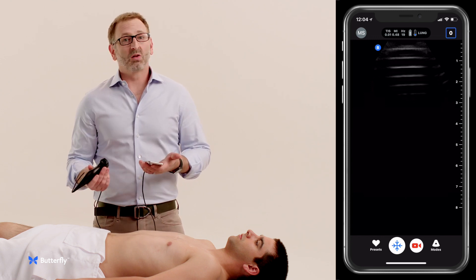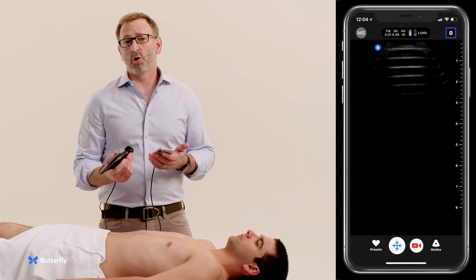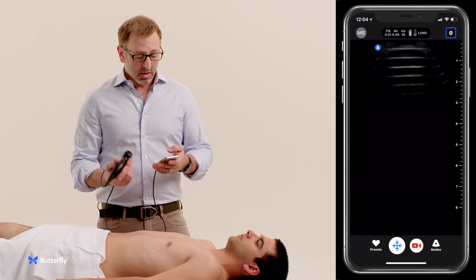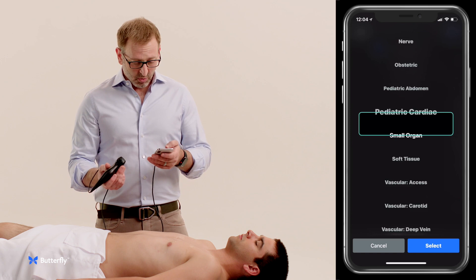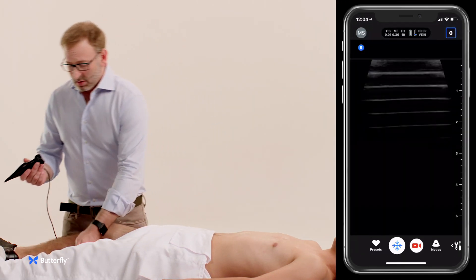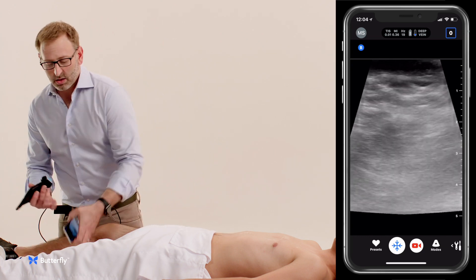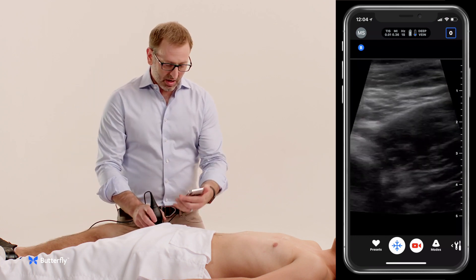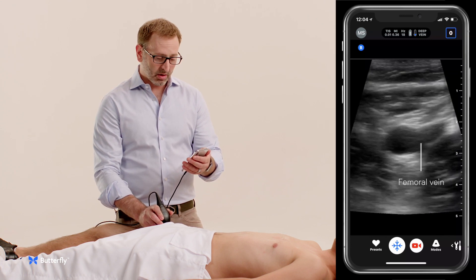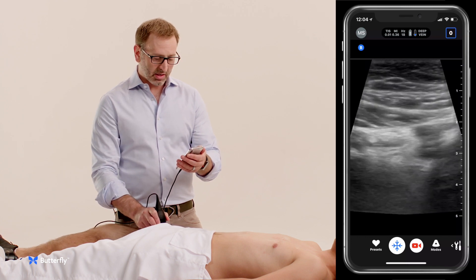We may consider, in the right clinical context if we're worried about pulmonary embolism, moving down to the legs to look for proximal deep venous thrombosis, which would be an indirect confirmation of a pulmonary embolism. Again, instead of changing transducers, we'll just move to a vascular deep vein preset. We'll come down to the leg and start in the femoral vein with the indicator to the patient's right in a transverse orientation at the top of the leg, identifying the common femoral vein, compressing it, and sliding down the leg compressing as we go.